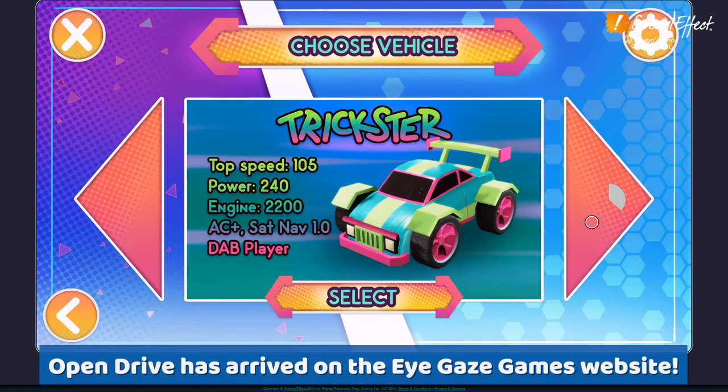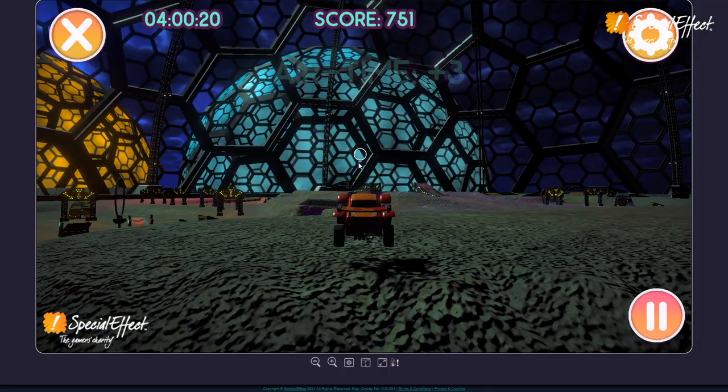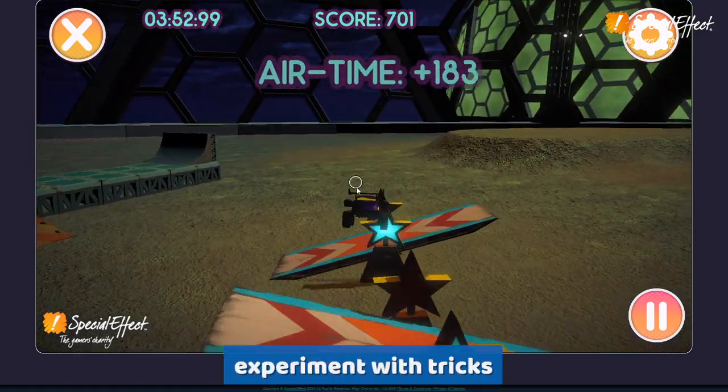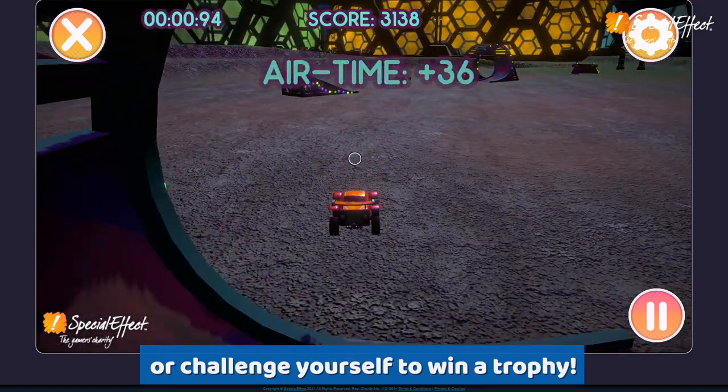OpenDrive has arrived on the EyeGaze Games website. With an EyeGaze camera, use your eyes to explore, experiment with tricks, or challenge yourself to win a trophy.